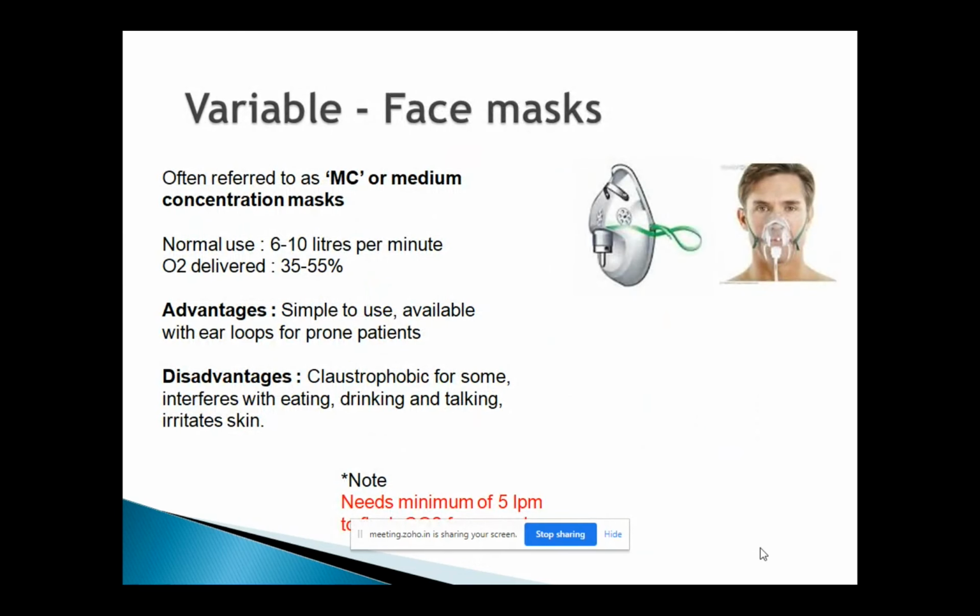This device, a very common mistake I've seen is patients will be put on 1 liter, 2 liters, 3 liters. But we know now this particular device is designed so you need a minimum of 5 or above liters of oxygen to stop the CO2 rebreathing. If you give only 2 liters or 3 liters of oxygen through this mask, patients are likely to breathe in what they are breathing out, and then they can develop CO2 retention.